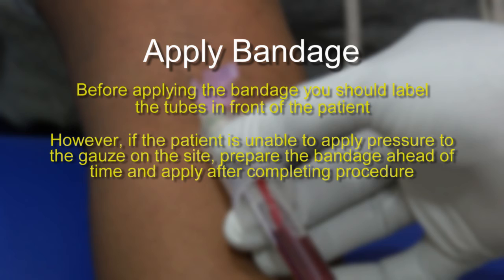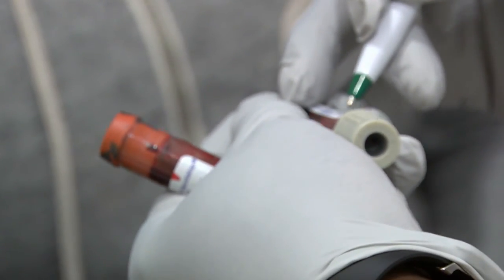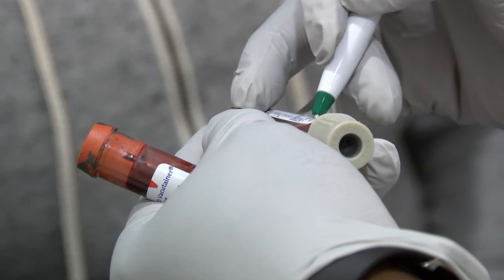Should you have a patient who is unable to apply pressure to the site, you should prepare the bandage ahead of time and apply the bandage upon completion of the procedure. So your name is Jane Doe.